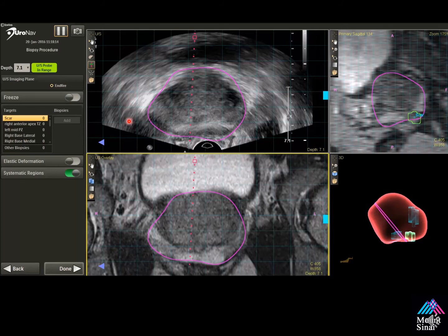I am doing this by myself, so I'm holding the probe. I have hit the freeze button on the foot pedal and I associate the image — I do this with my left hand, holding the probe with my right hand. Now we're at the sagittal view — I just rotated my wrist 90 degrees to get this other image. I'm able to put the needle in right below the hypoechoic area and target directly through it. Typically when you take a picture and freeze the frame, it doesn't always represent what your biopsy looked like. That's why I really like the videos — it's very important.